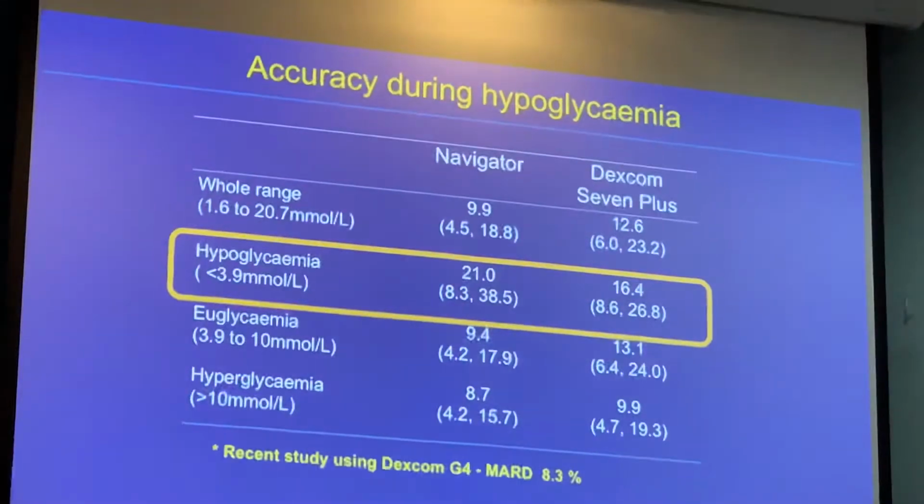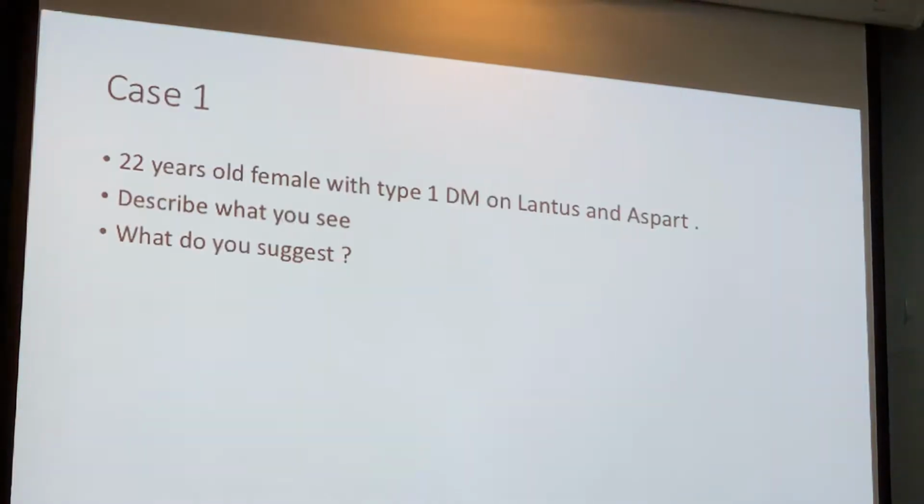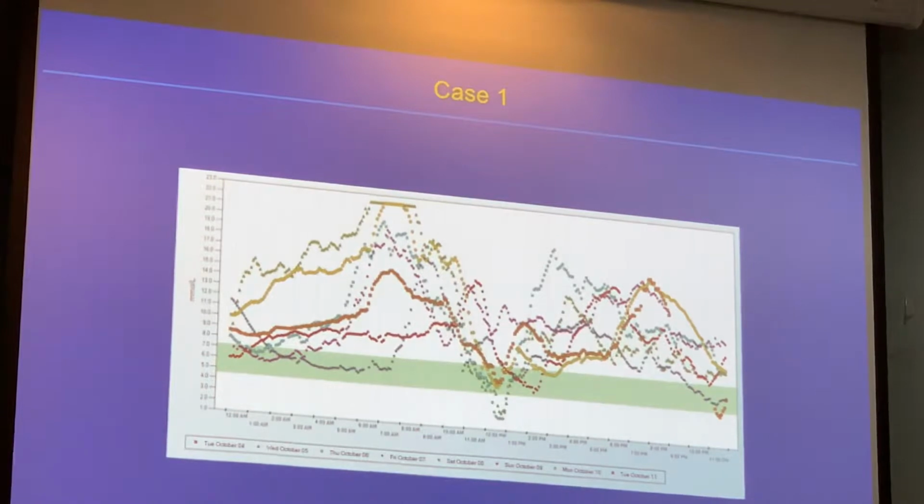So let's see here. So this is a case that you see. You know, some of you, the spot on got it right. So what is it here? Yeah. So basically, this is a dawn phenomenon, which is what? Like, what is the significance of the dawn phenomenon? Why is it happening? Because you can't enough. Insufficient. Right. What time of the day?